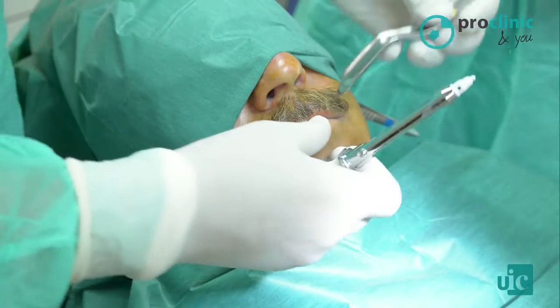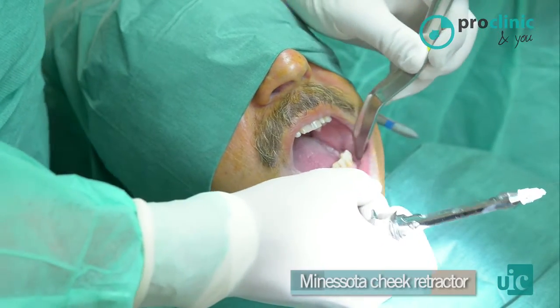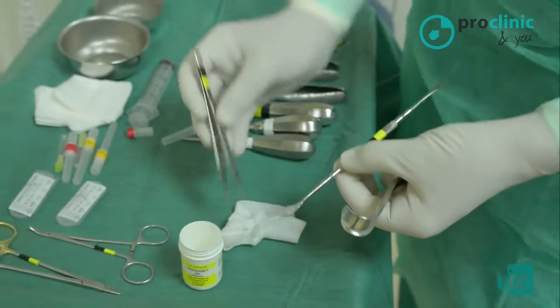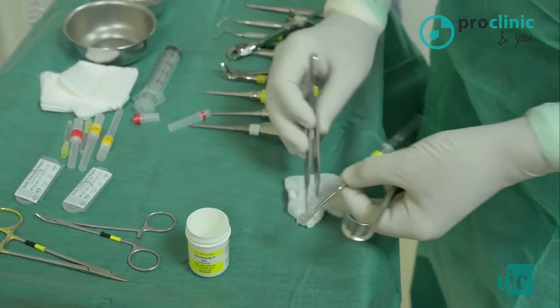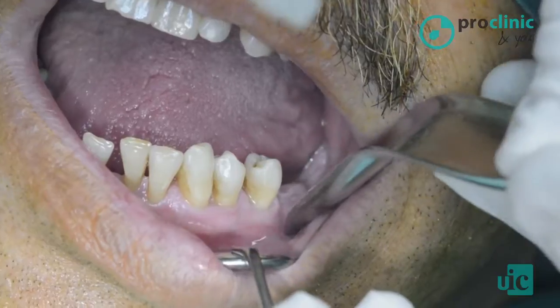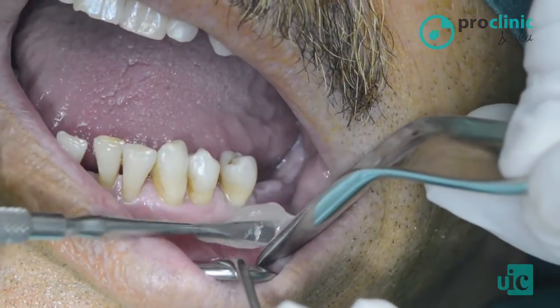Now we are going to use a cheek retractor, specifically a Minnesota retractor. This is a benzocaine gel. We are going to apply it on the area where we are going to make the puncture to minimize the pain.